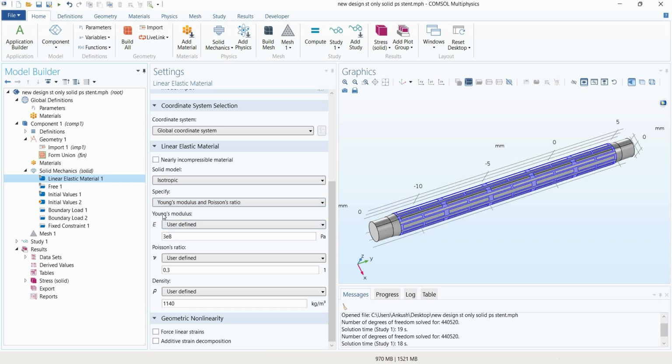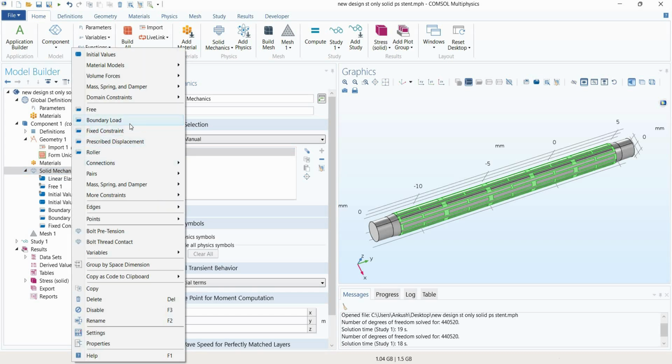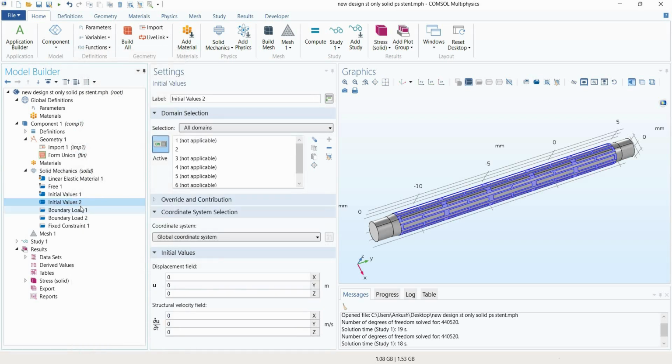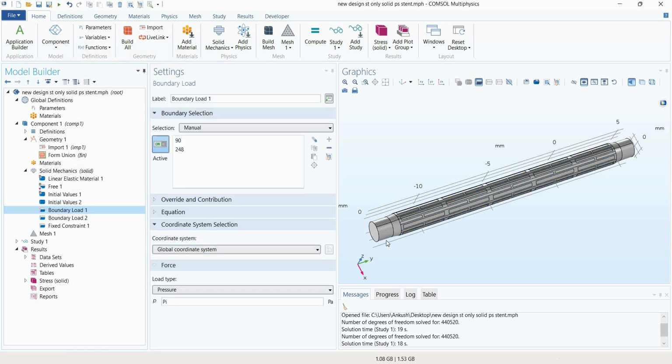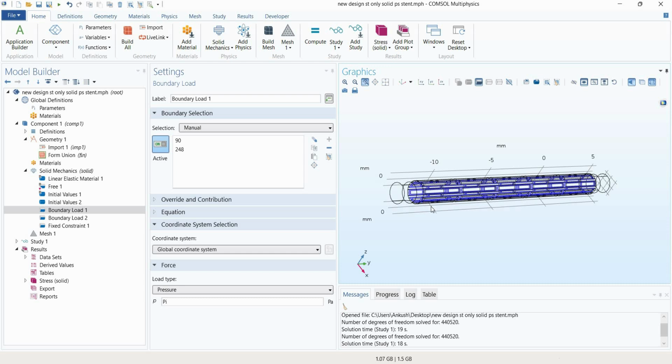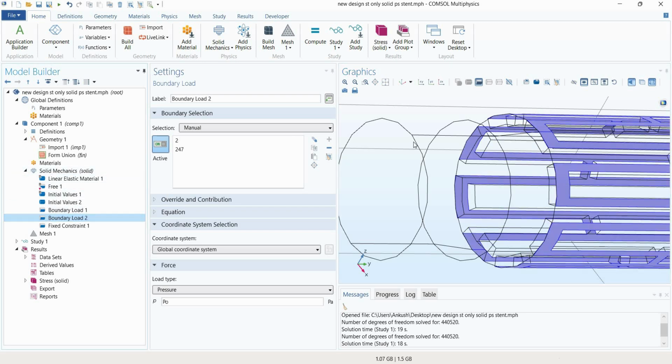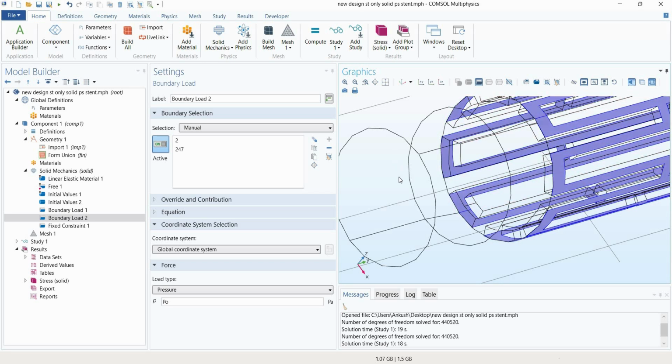As you can see here, we have given the Young's modulus, Poisson ratio, and density. For selecting the stent we just click here and select the stent, as you can see. Then by right-clicking on solid mechanics we click on boundary load. For this boundary load we have selected the inner part of the stent, because it is the inner boundary load. Then we again click on boundary load, and in this boundary load we have selected the outer part of the stent, as you can see here.